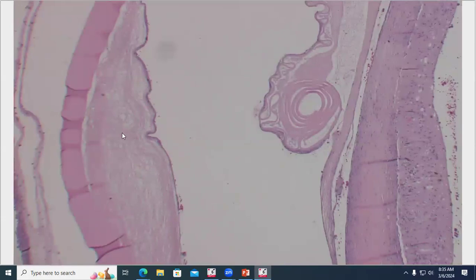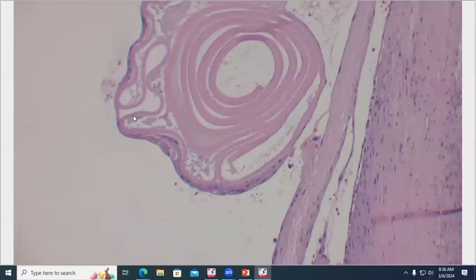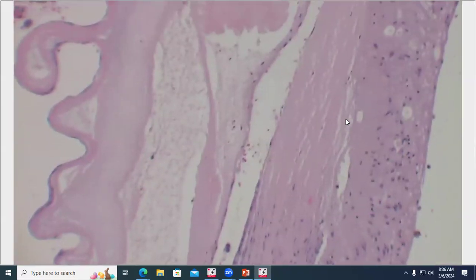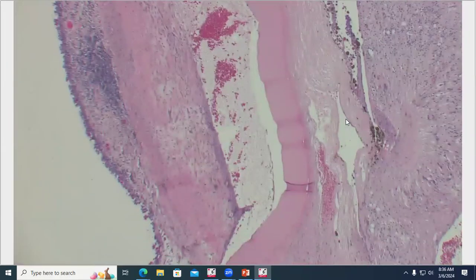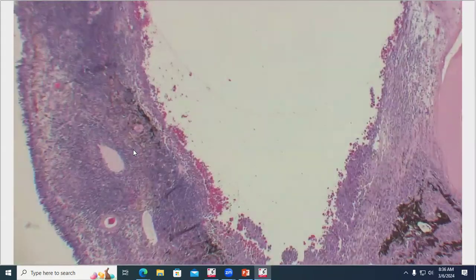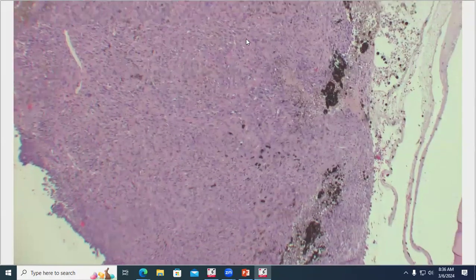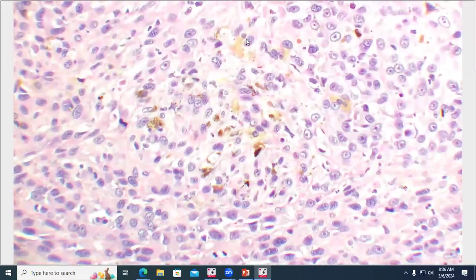And so if we look here in the lens, we've got some fibrous metaplasia of the lens epithelium. We can see it coming around the lens capsule, posterior migration, and heading out into what are streams of spindle cells starting to form here. The streams of spindle cells extend from the lens capsule rupture all the way down here. They line the ciliary body here. This is a little bit more inflammatory on this side, but again, we've got cells lining it, and then they cross over the pupillary margin here on top of the lens capsule. Then we've got these spindle cells expanding and effacing the iris and ciliary body. I think on this side it extends into the choroid, which I'll show you in a second.